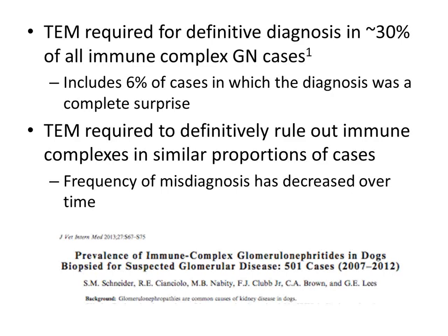But I do think that this does show that TEM is required, and this is actually in line with what they see in human medicine as well, about needing advanced diagnostics, whether it be IF or TEM, for the definitive diagnosis. And I'm going to check for questions really quickly. No questions.